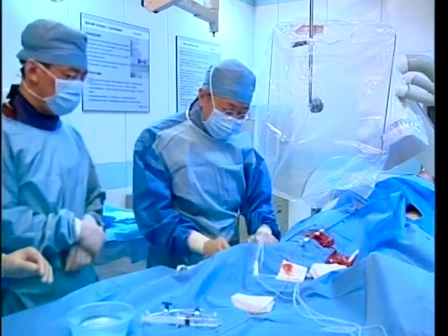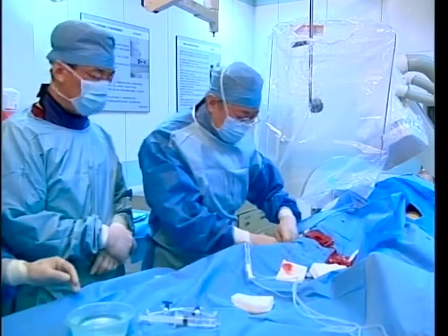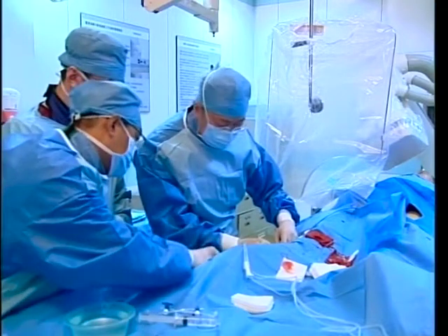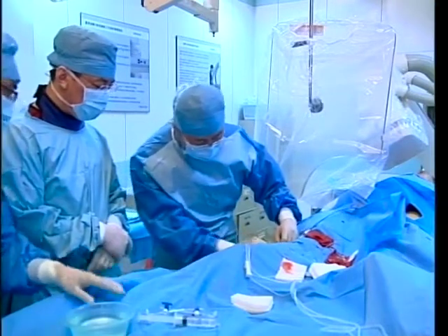And because the size of the sheath is quite small, 10 French, you can actually put in a needle and use this sheath as a direct septal puncture sheath. So you don't really need an additional set of puncture system. So theoretically, if you use this sheath for puncture, then you can shorten the procedure to around 25 to 30 minutes.